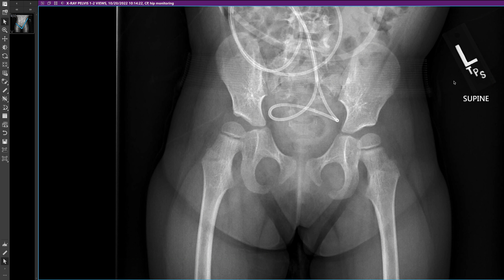Here is a typical example that we get and we're asked to make measurements on. First, a few things to look at. We need to make sure the hips are relatively symmetric, and I do that by looking at the relative sizes of the obturator rings — they look pretty symmetric here. Making sure that the very lower end of the coccyx is in midline with the symphysis pubis, and the distance between the top of the symphysis pubis and the bottom of the coccyx is somewhere between one to three centimeters.